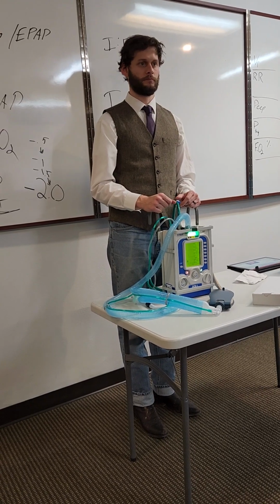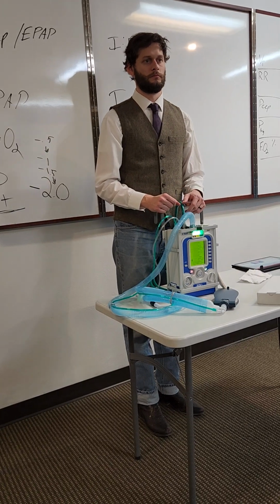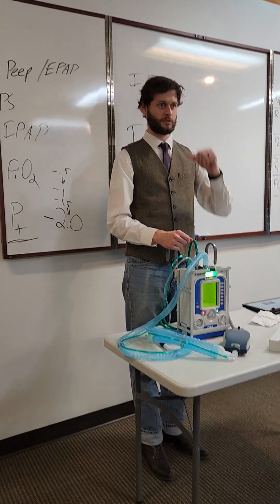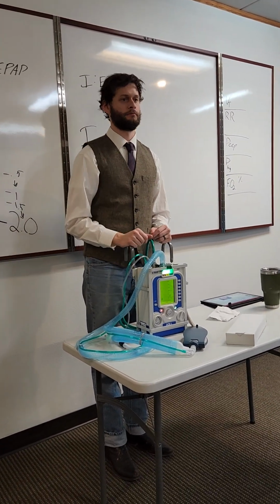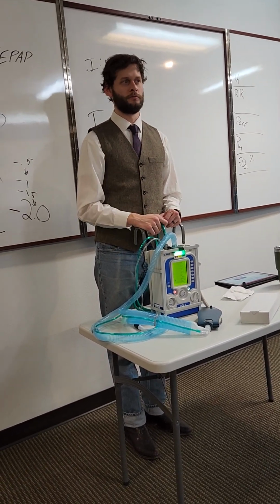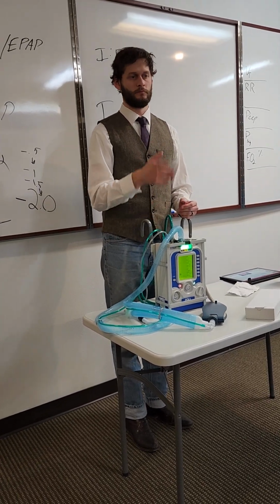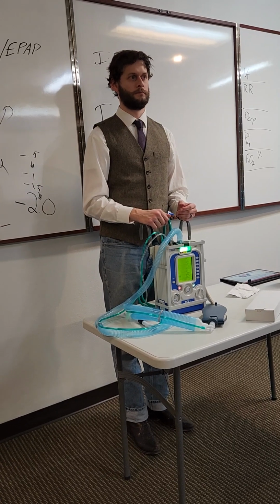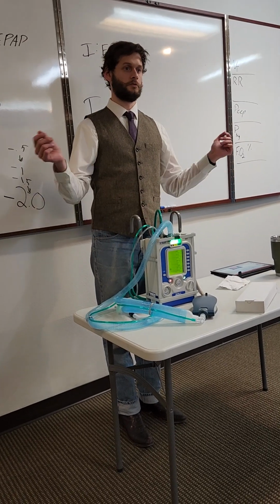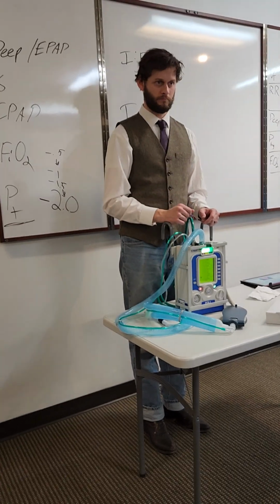But when you turn that off and turn it back on, does it go to a most common setting? It already has the preset settings. If you click adult, it's going to go to its adult setting, which is something like 450 tidal volume, rate 12, things to deviate from. When you turn it on, it's always going to be those numbers. So you go back to the previous settings, and boom, it'll hold previous settings as long as you need it to. If we don't use that vent for 2 weeks, you come back and hit previous settings, it'll be that patient from 2 weeks ago.